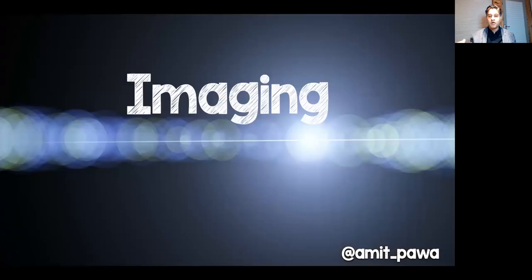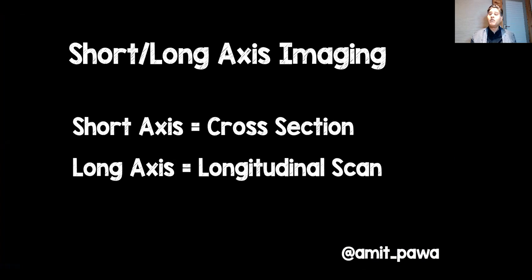Okay, so we talked about the probe, we talked a bit about the machine. What about imaging? So clearly there are two different ways that you can generate an image, broadly speaking, with ultrasound. You can take a short axis view, often abbreviated to SAX, which is a cross-sectional view, or a long axis view, which is a longitudinal scan.